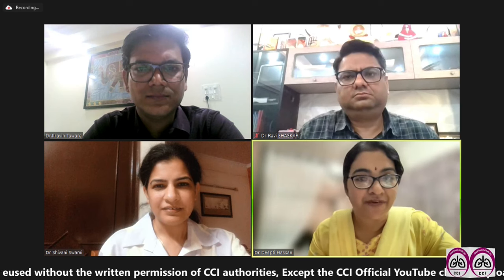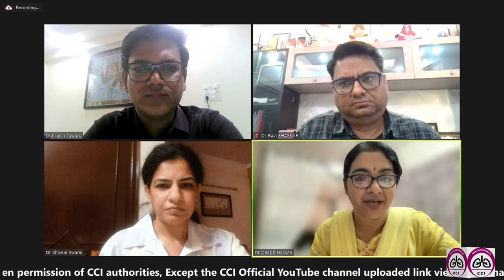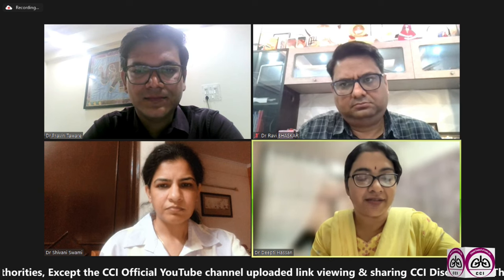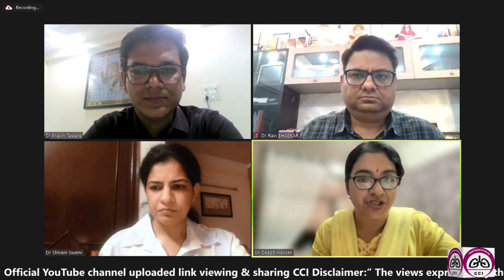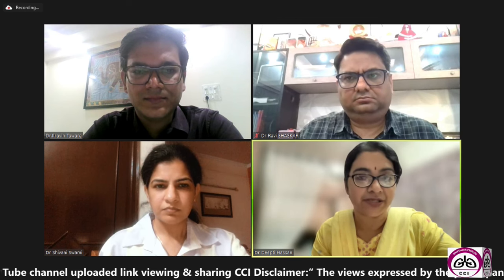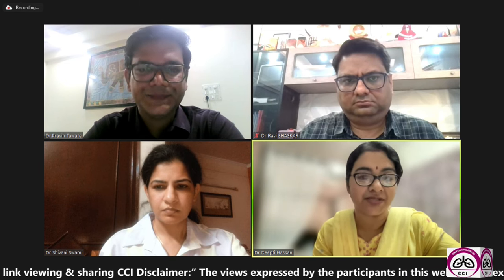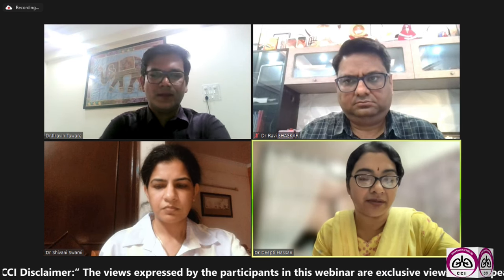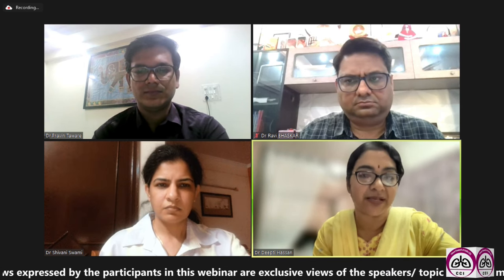Yes, thank you for the question, ma'am. The efficacy of the spacer I've already mentioned in the talk. It is an add-on to the MDI. If the patient does not have good hand-to-mouth coordination, that is the reason we use a spacer. Any patient, from a child to an elderly or incapacitated patient, can use this option if they don't have a nebulizer. Even in acute conditions and emergency situations where a nebulizer is not available, a spacer can be used with multiple single-dose actuations to replace a nebulizer.